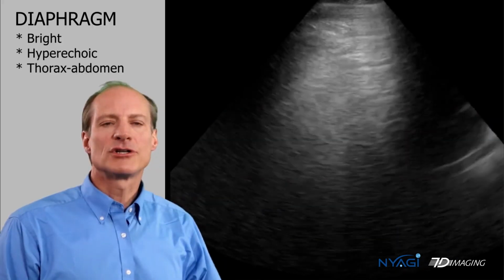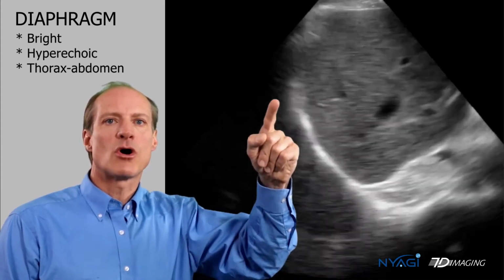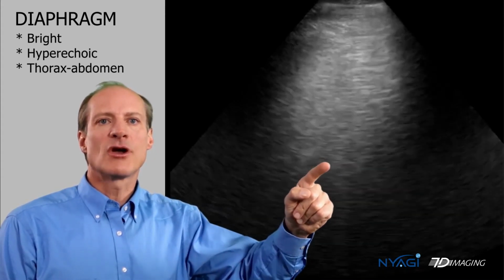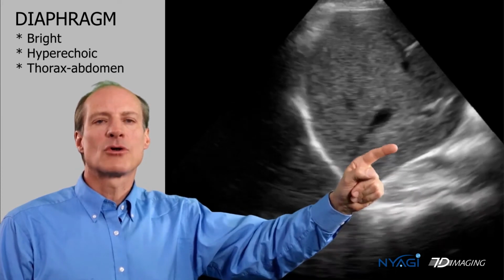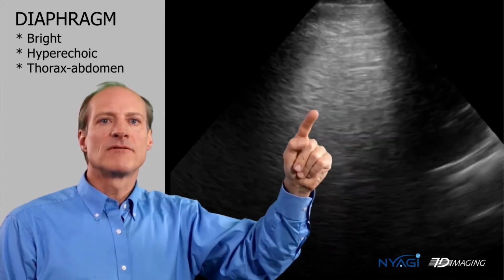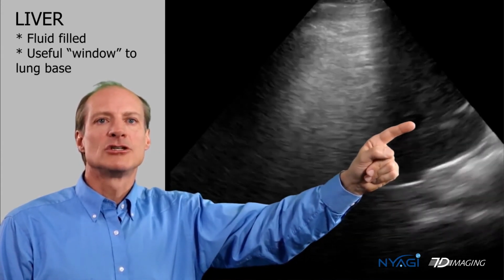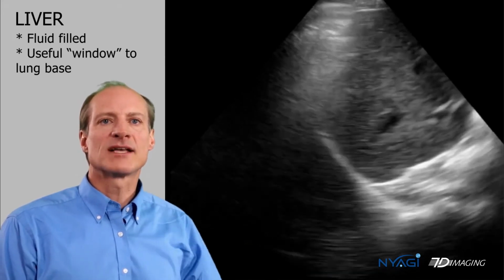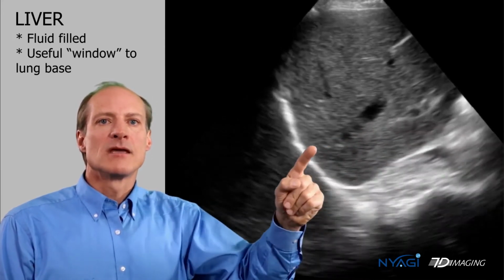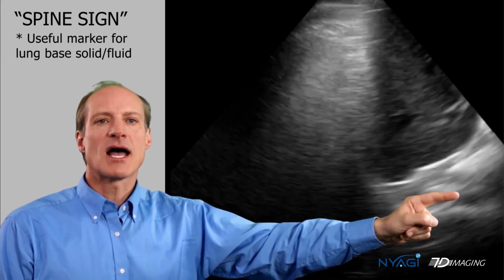It's important to define the edges of the lung. So you have the ribs on the chest wall, and the inferior part, you have the diaphragm and the abdominal organs. Here you can see a hyperechoic diaphragmatic reflection next to the liver, which, unlike air bronchograms, shows dark vessels, not bright white. Deep to the liver, you can see a reflection of the spine.